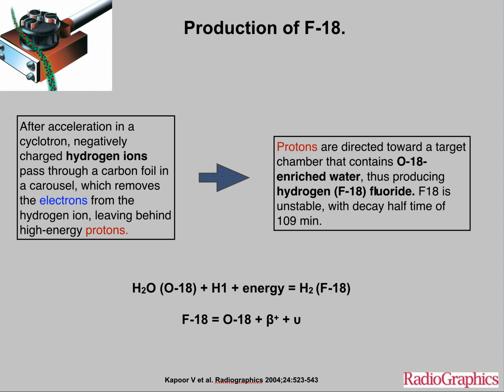The decay half-time of F-18 is 109 minutes, which makes it essentially an ideal isotope. It's long enough that we can deliver the dose to an imaging site, but yet doesn't stick around for days, so the radiation amount that's delivered to the patient can be reasonably controlled.